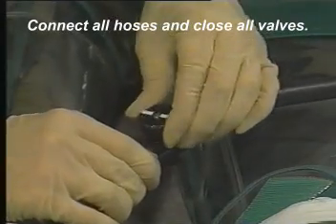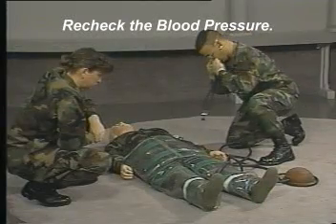Connect all hoses and close all valves. Recheck the blood pressure.